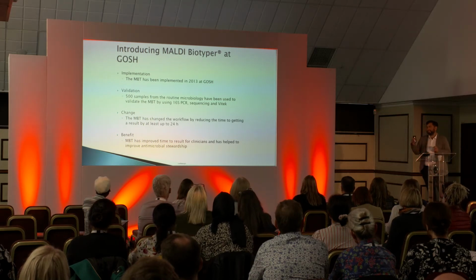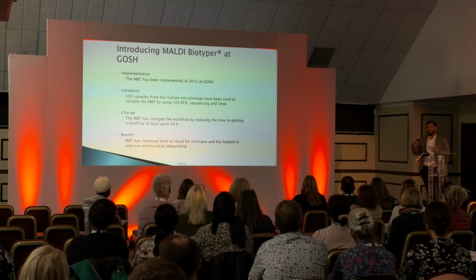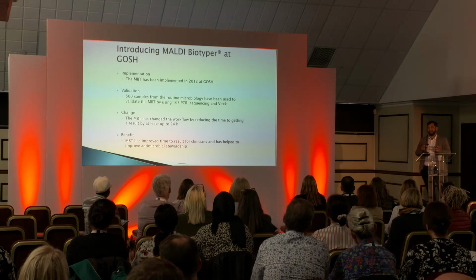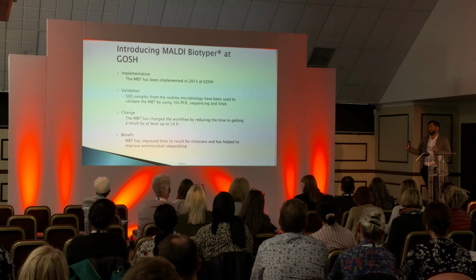So yeah, as I've said, and kind of harping on it, it has improved things when it came into the lab, because the lab utilised it so much for ID and was so reliant on it for getting those IDs, and it reduced cost as well. In the laboratory, we use a number of chemical tests, etc., and actually we could stop using those because we were using the Maldi-TOF, and it was cheaper as well.